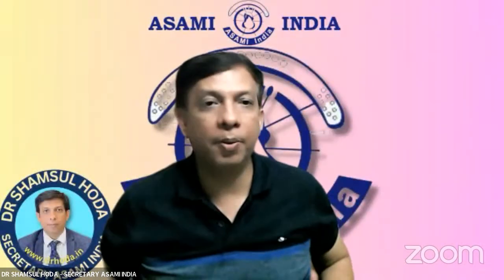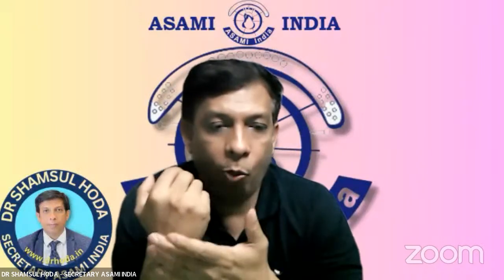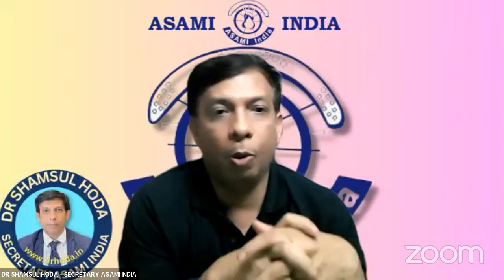Sir, I have a question, sir. Srinivas, sir. Yeah. Sir, in distal humerus fractures or non-union, what do you do to avoid elbow stiffness, sir? What is the protocol from your side, sir? Yes, that is a good question. The basic principle of passing wires is we have to stretch the muscle through which we are passing the wire. If you are passing through the biceps, we have to extend the elbow. If you are passing through the triceps, we have to flex the elbow. These are the basic principles we follow everywhere in Ilizarov, so that after wire passage, we have a good excursion of the elbow movements.